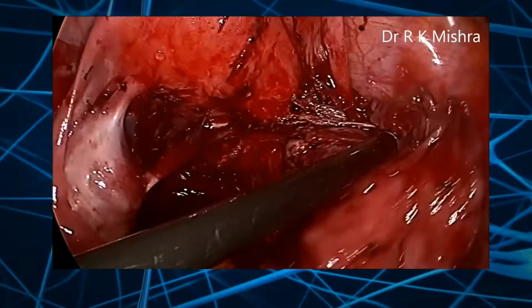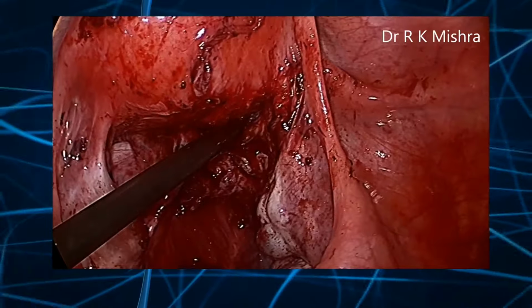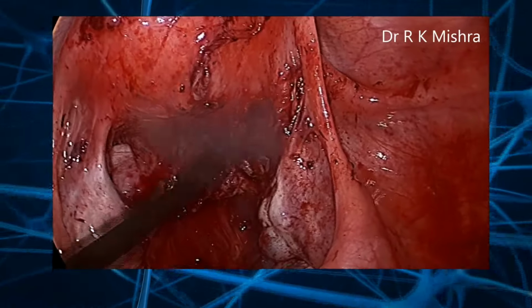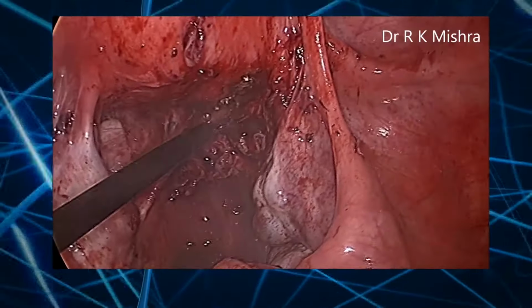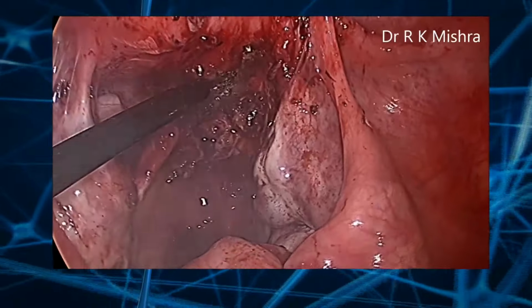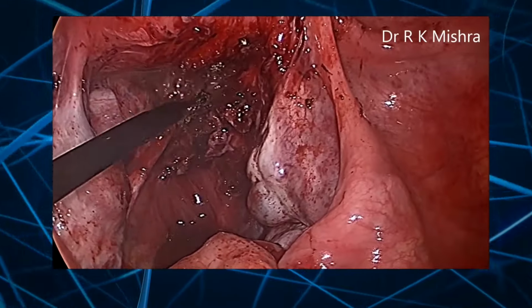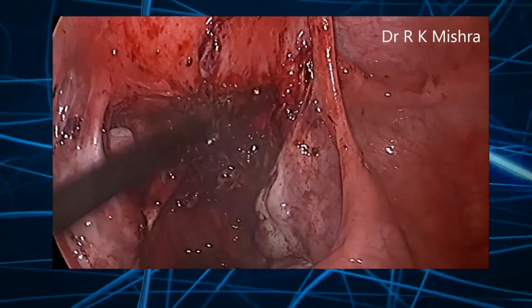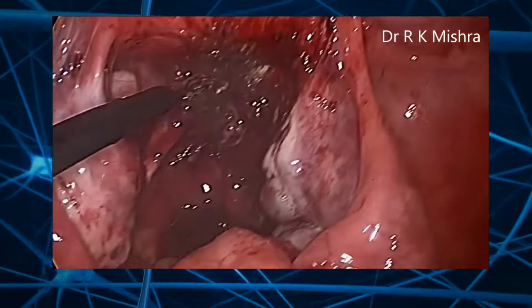No, it is separated. Then this is fulguration. With the spatula, you will fulgurate this entire area, and any remaining wall endometriosis has to be completely fulgurated 2-3 times. You fulgurate and again irrigate, so that this burnt tissue will be washed out.